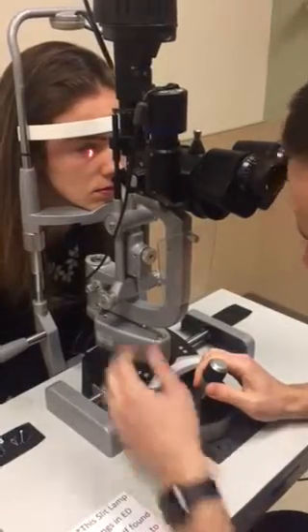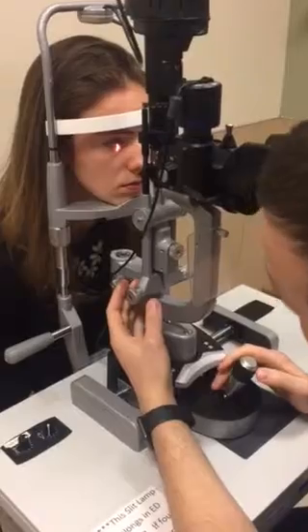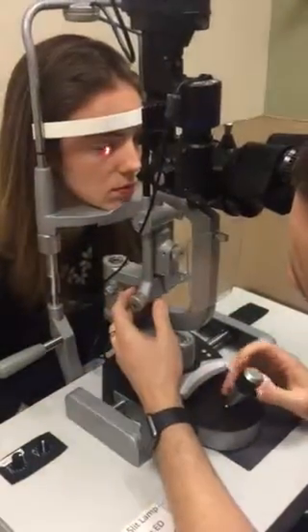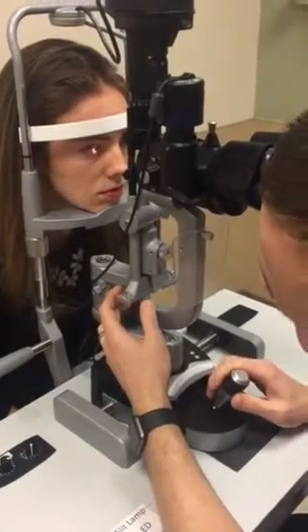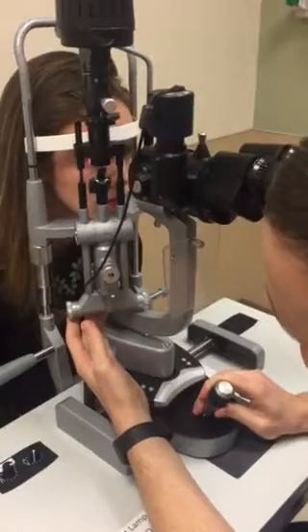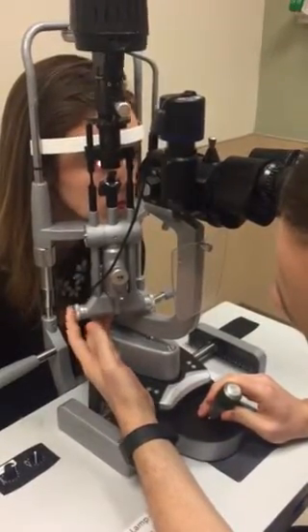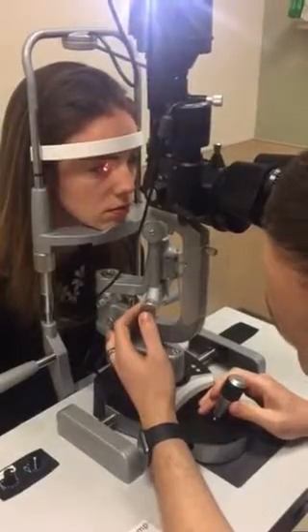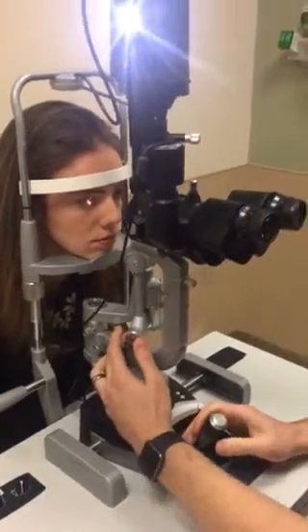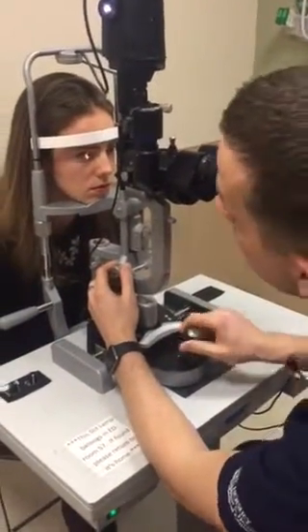The other thing you need to work with is the slit lamp angle adjustment, which moves 180 degrees. When you look at the temporal side of the eye, you want the light coming in tangentially — so if I'm looking temporally, I'm coming in at a 45-degree angle this way; if I'm looking nasally, I'm coming in at a 45-degree angle the other way. With respect to doing the exam, it's important to have a systematic approach.